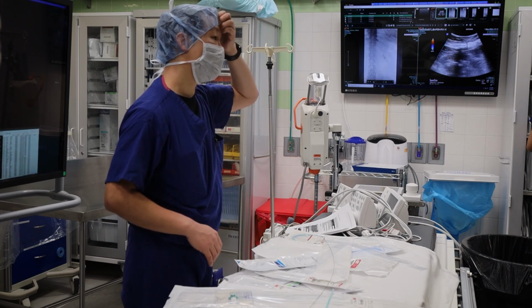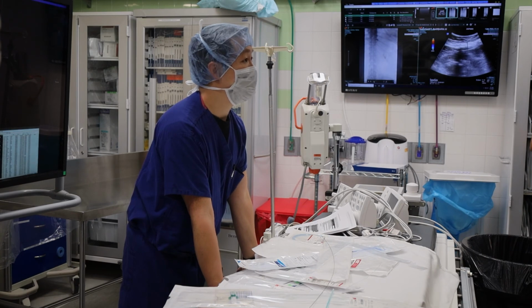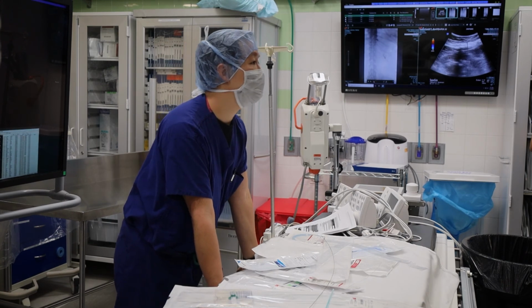Real quick on the exchanges. I'll look at the patient and decide how long they are going to have the tube. Are they expecting to have the tube removed in a few months and so forth? We try to plan ahead to figure out what's the best thing for them. Yeah, good question.